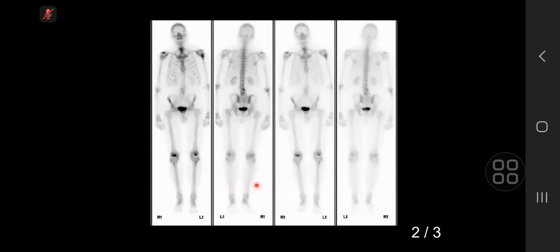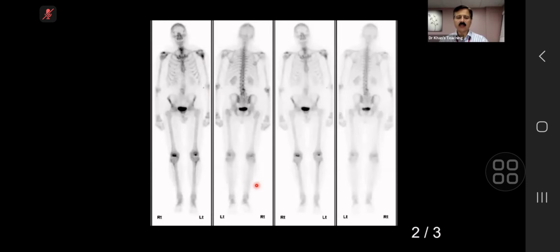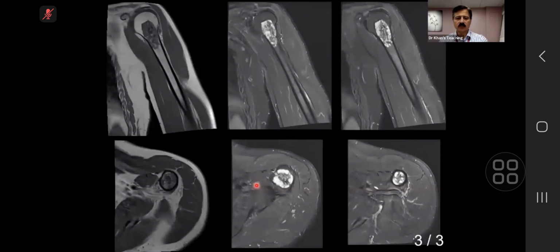I'm not sure that the presence of uptake is particularly helpful, because the underlying benign lesion might well take up tracer. Excellent. So that's the key, and this has come in the viva also. Please remember that up to 30 to 35% of enchondromas can show uptake on nuclear scan. This is not taken as a sign of malignant transformation. Indirectly, nuclear scan hasn't got the specificity.